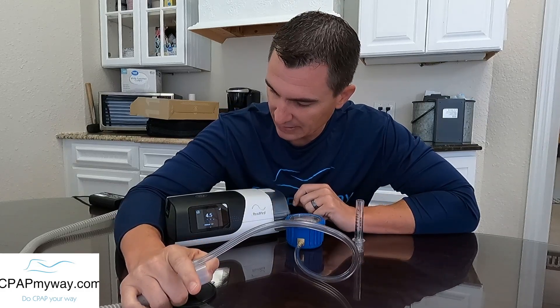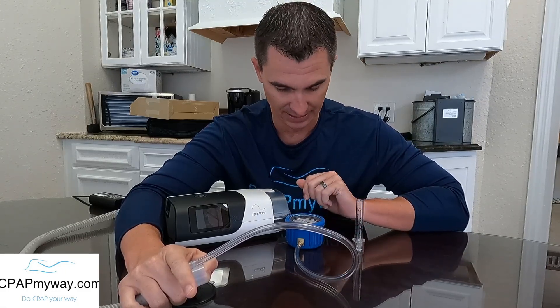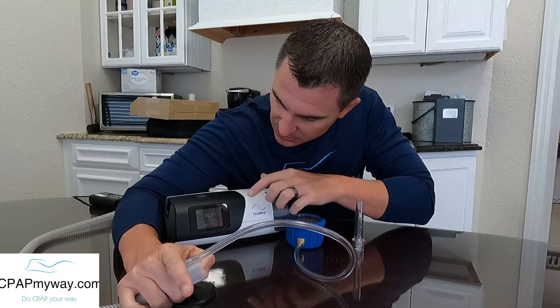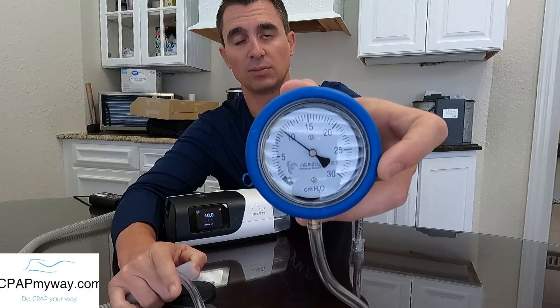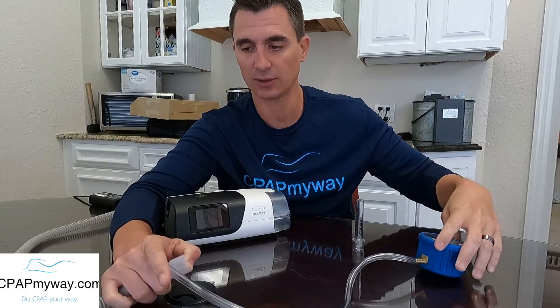First, remember that your CPAP could possibly have the ramp turned on. If ramp is on, it's not going to go to the full pressure — it'll stay at the minimal ramp pressure. Right now we've got this machine running at a 10, and you can see on the manometer we're blowing at just about 10 on the pressure gauge. So we know on the professional manometer that we are at the right pressure.